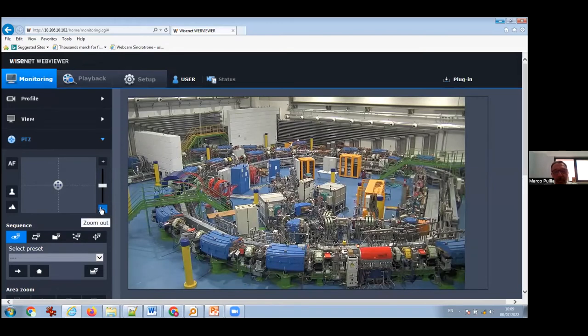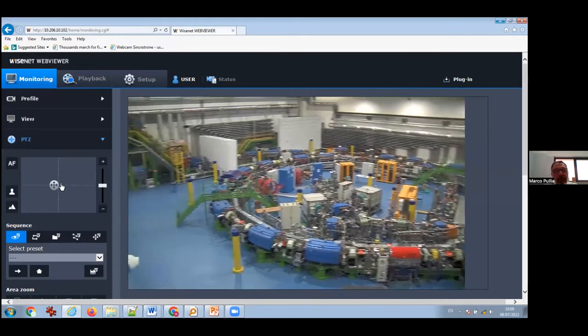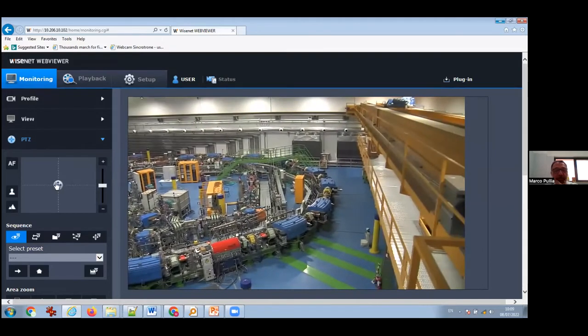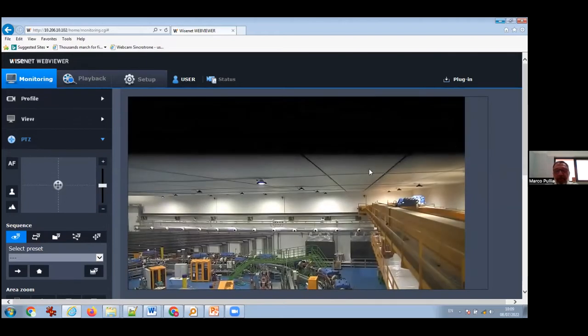And then, just to mention it, you may have noticed there are no columns in the synchrotron room, which means that from the building point of view it is also a non-trivial thing. You see here on the roof we have these beams, which are 37 meters long, 2 meters wide, 2 meters tall, more or less.